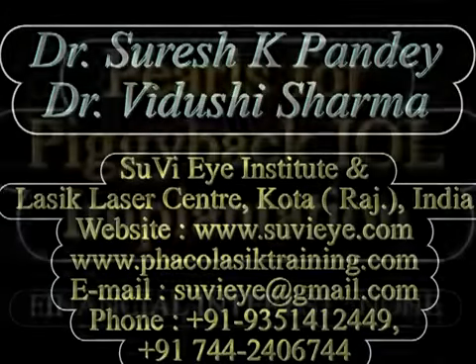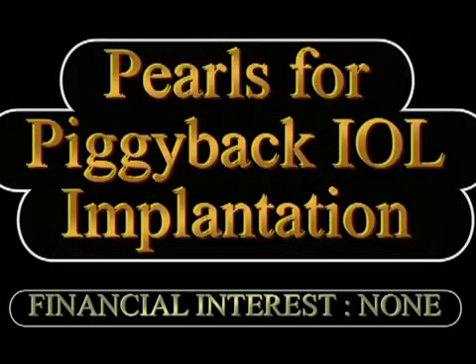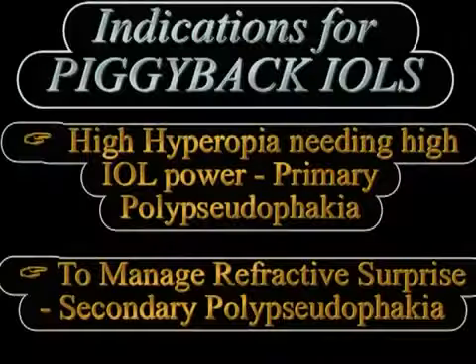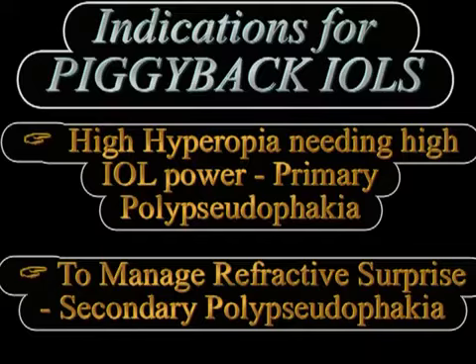Hi, I am Dr. Vidushree and in this video we describe the pearls for piggyback IOL implantation. Piggyback IOLs can be implanted either to manage refractive surprises in a secondary manner, or primary piggyback IOL implantation may be done in cases of high hyperopia which need a very high IOL power.